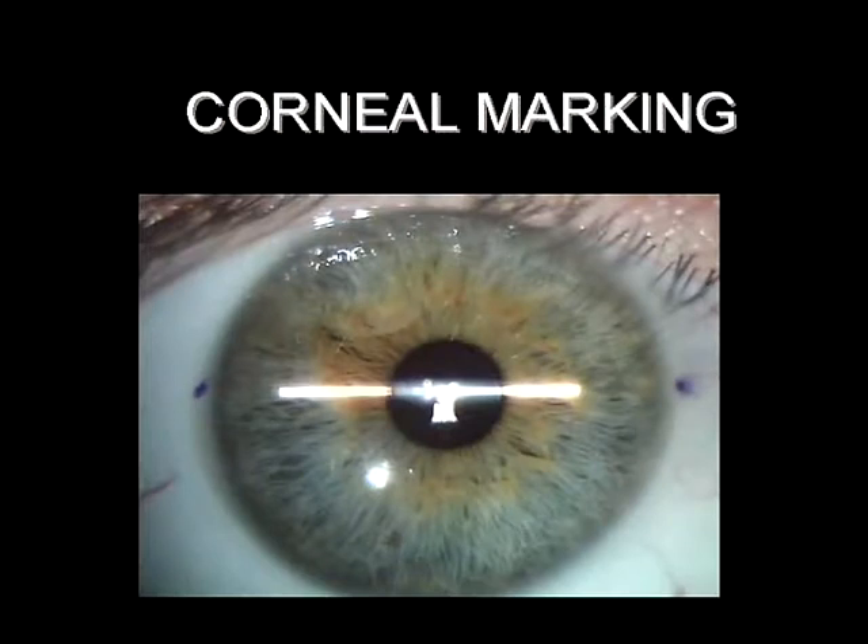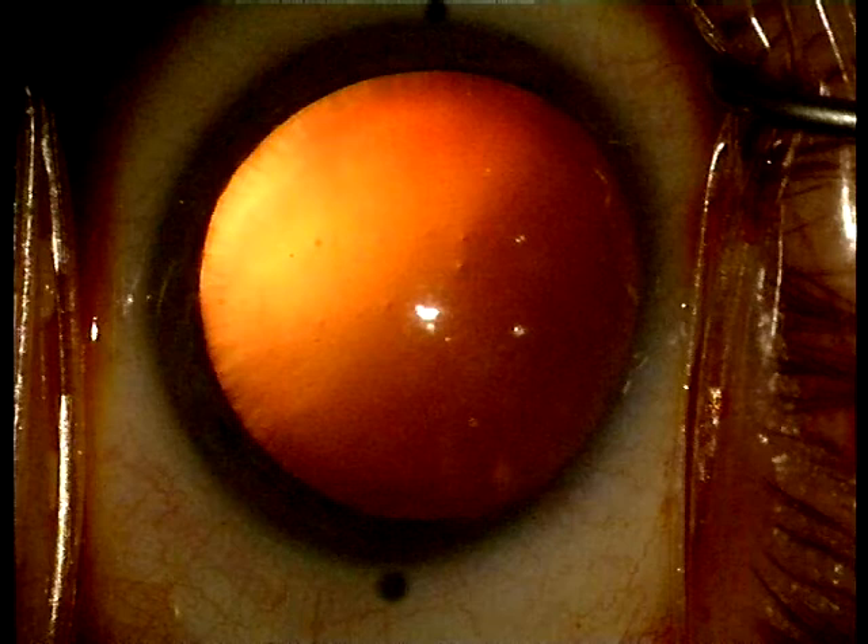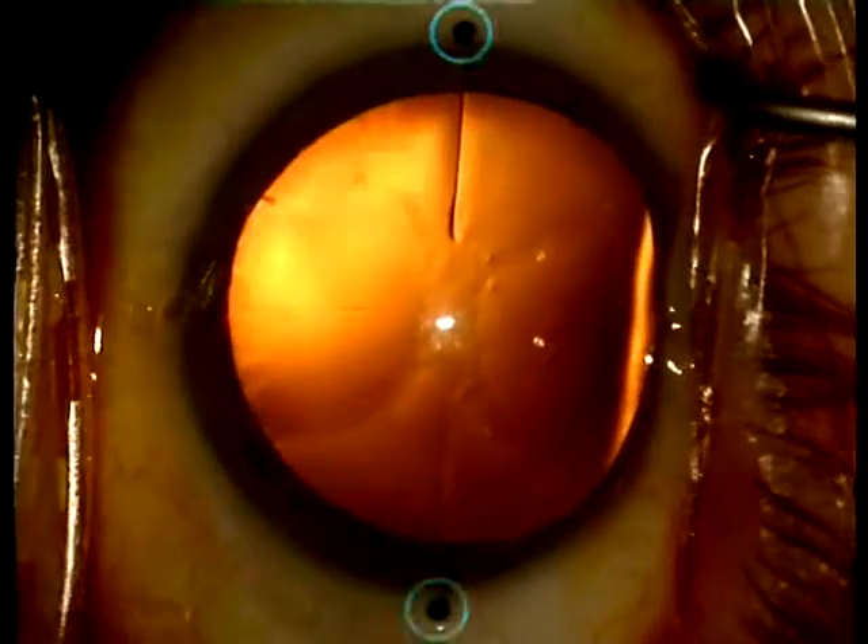Before the patient is placed on the operation table the horizontal axis is marked at a slit lamp and two dots are placed at the limbus. The markings at the limbus indicate the horizontal axis. This axis is highlighted with a marker which is firmly pressed onto the cornea to create epithelial indentations.